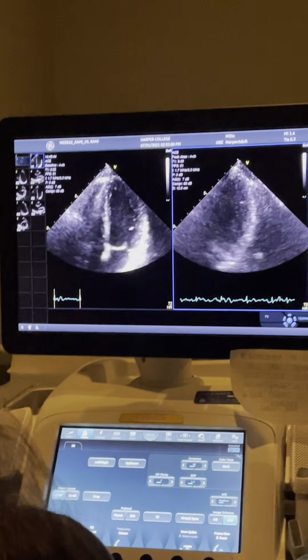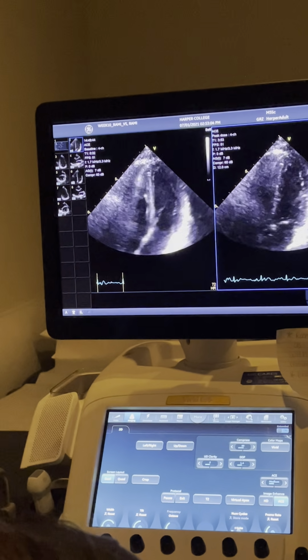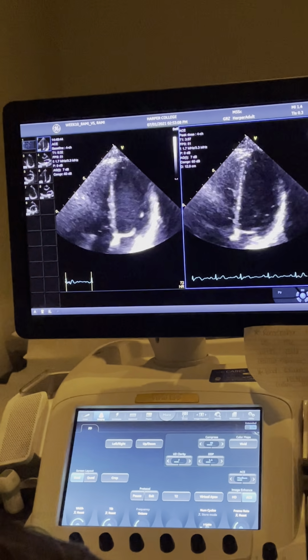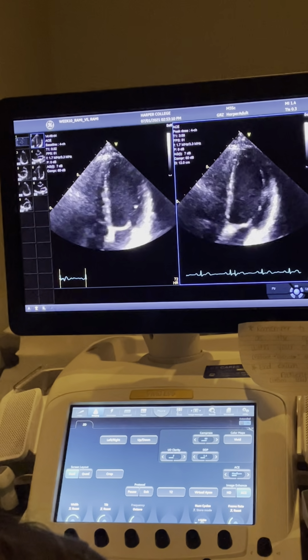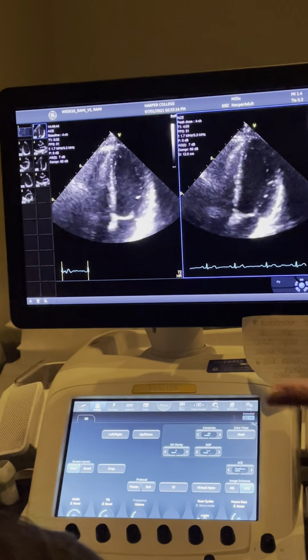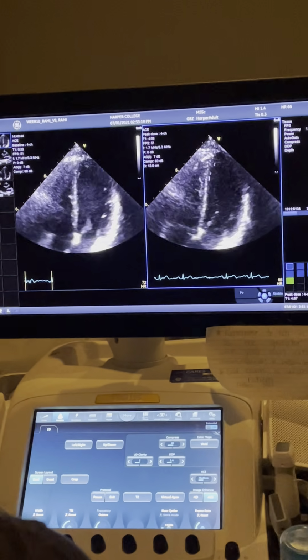Most of the time a physician should be in the room because if you give atropine, they have to tell you what dose. They have to be there to monitor the patient. It's a serious drug. So we try to avoid having to give it, but if they aren't making target and we've maxed out on dobutamine, they will go ahead and push atropine. So it's nice if the physician's in the room. The first job I had, they would be in the room and they'd say, okay, grab your mids, grab your low dose, grab this now.